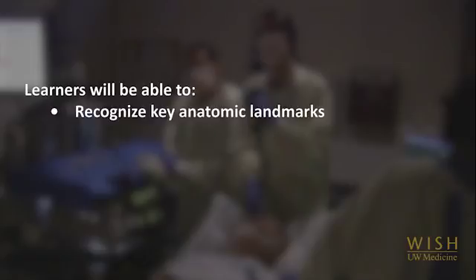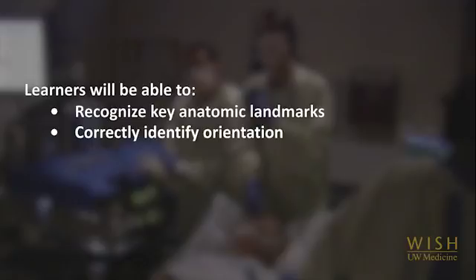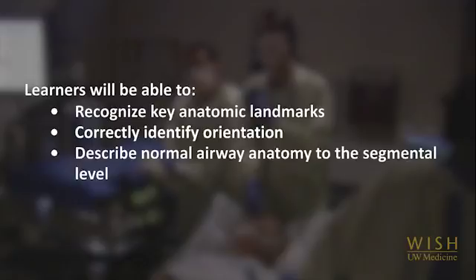In this module, we will demonstrate inspection of the lower airways by flexible bronchoscopy. During this, we will point out key anatomic landmarks to keep you oriented within the airways, and we will illustrate normal airway anatomy to the segmental level.